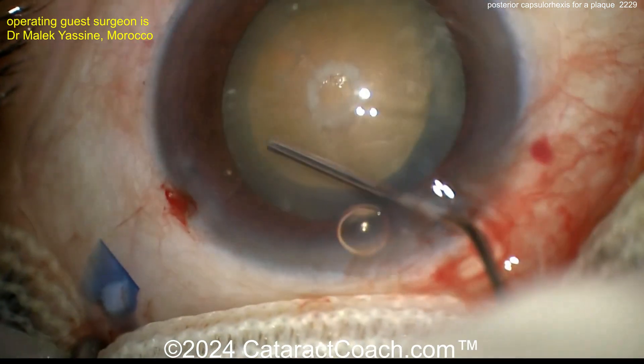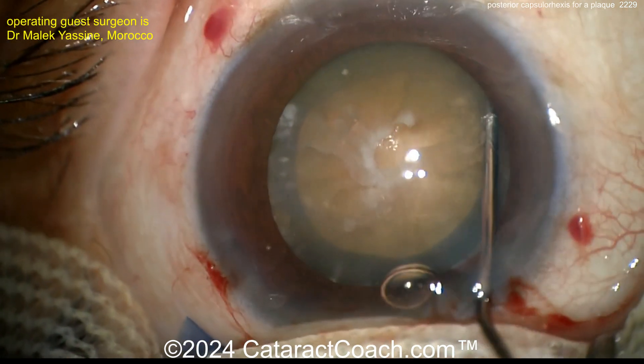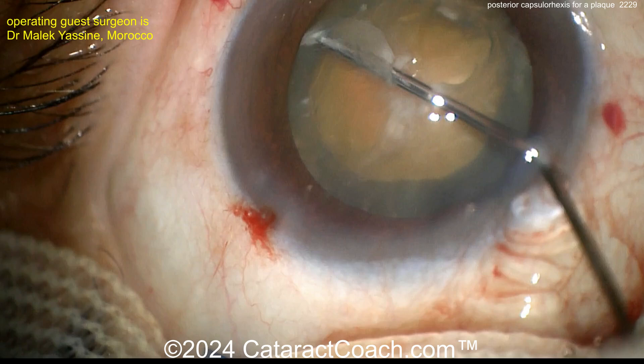Because the cataract is relatively dense, there's not much view of the hydrodissection, so be very cautious here. Dissecting a little bit more to get that lens freed up so it can rotate.